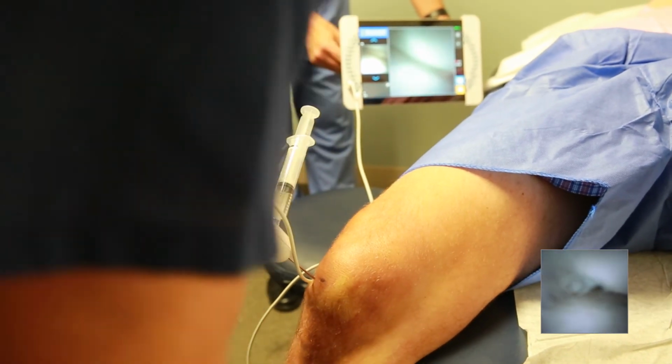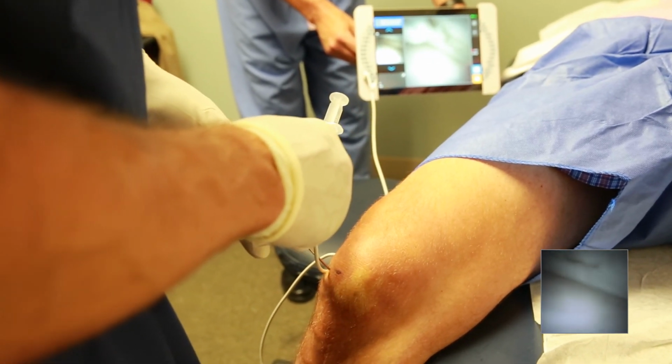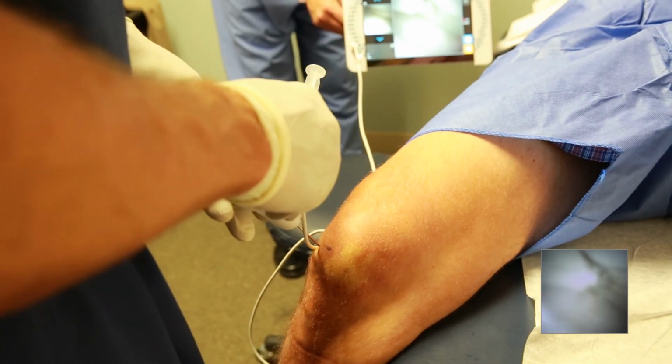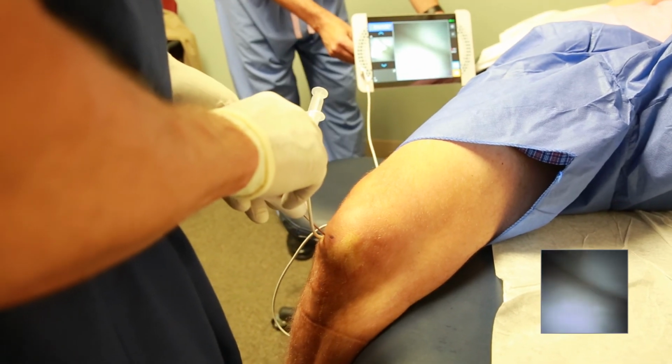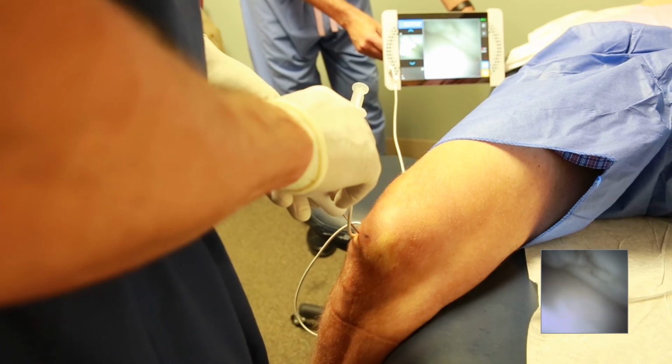If we bend you more, you can check his whole femoral condyle, and you guys can see that cartilage defect. Now that's a big flap of cartilage, and we can get a nice picture of that. That's where my pain is? Well, that's where your catching's coming from. Your pain is from that. So you have the option of going in and debriding that.